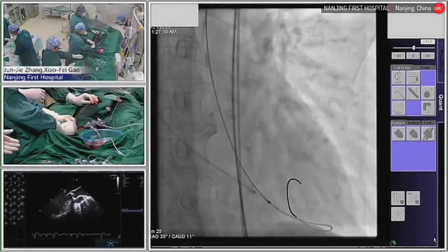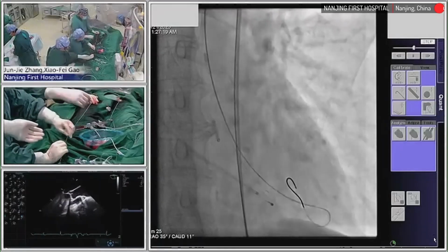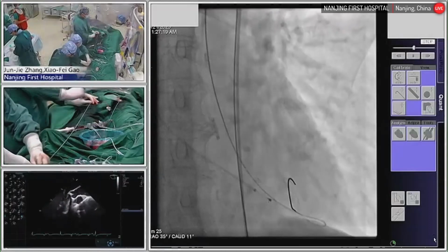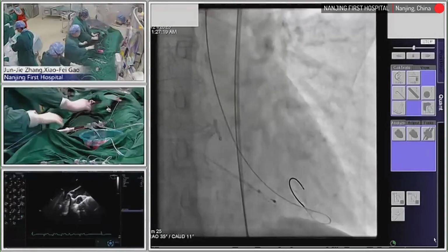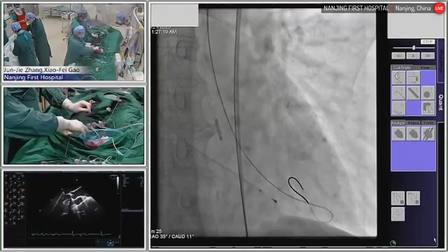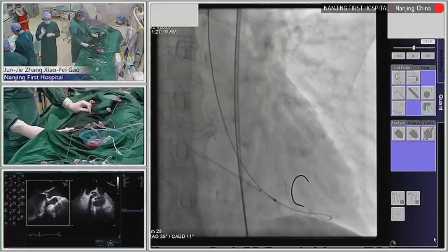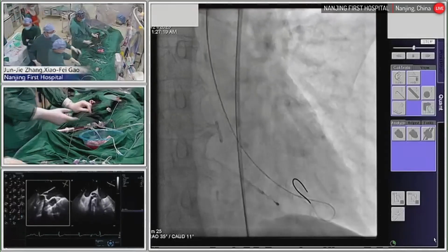Professor, do you perform pre-dilation for all these TAVI patients? Sure. For this particular case, we definitely will dilate because it's a very eccentric calcified annulus and severe stenosis without any regurgitation. So I will do the balloon dilation with the 18 millimeter balloon before I insert the TAVI.